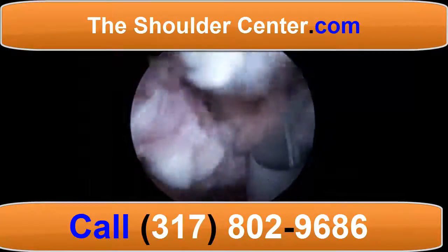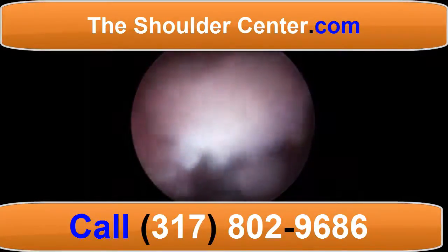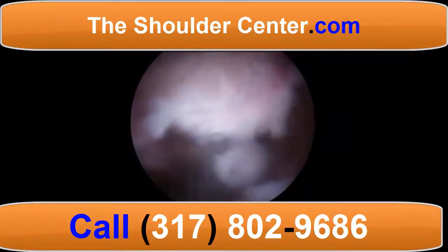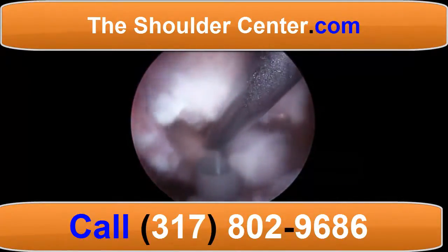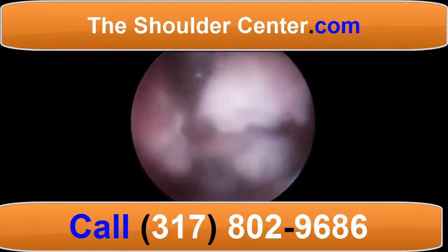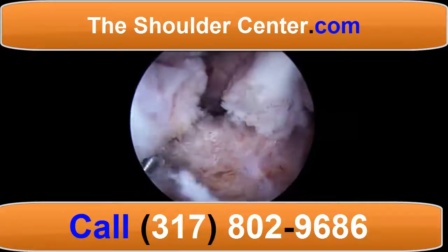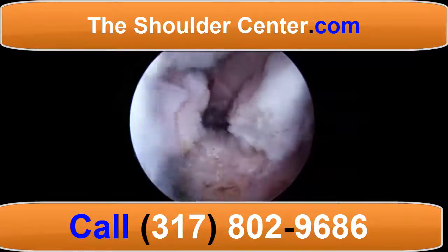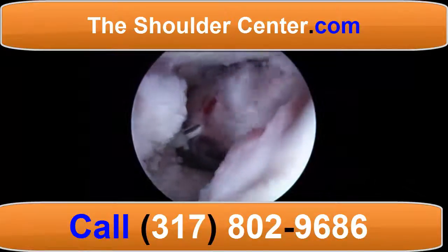Superior capsular reconstruction starts with anchors placed about a centimeter medial to the articular margin at the superior glenoid. The first anchor is placed in the posterior superior quadrant and we retrieve one limb from the anterolateral portal. Now the second anchor is placed anteriorly and we prefer to place this in a transcoracoid fashion.